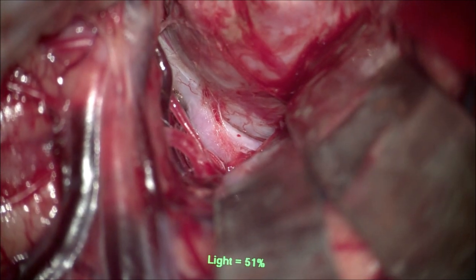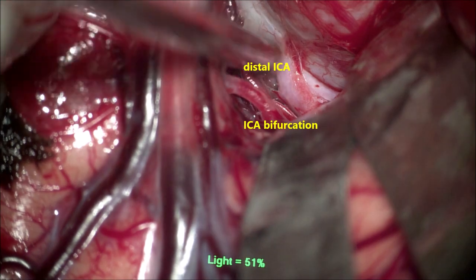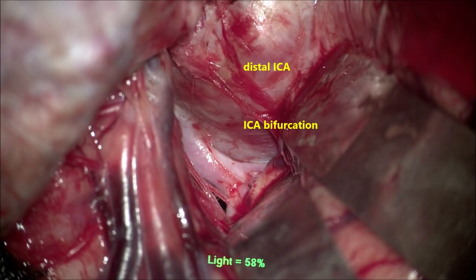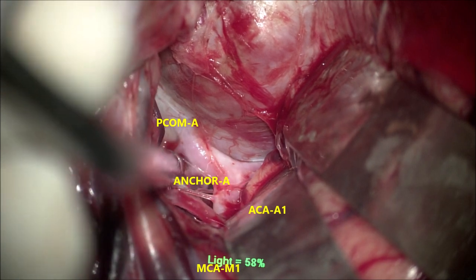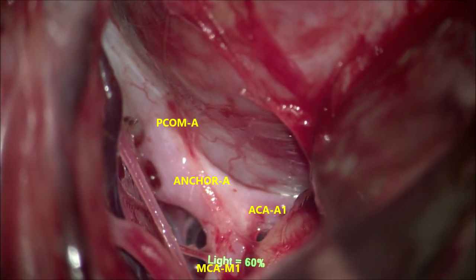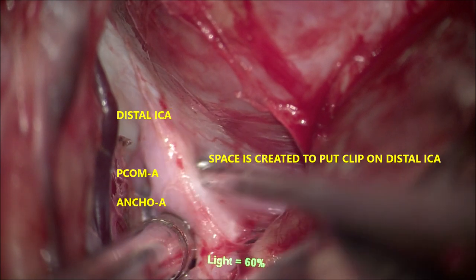Now we can well demonstrate the distal ICA, and the aneurysmal dilatation of the ICA itself in the giant form is clearly seen. We can see the distal ICA, the origin of the posterior communicating artery, and the anterior choroidal artery from the distal ICA. A space must be created between the dome of the aneurysm and the distal ICA to apply the clip. The bifurcation of the ICA into A1 (ACA) and M1 (MCA) is demonstrated medially and laterally, and the perforators originating from the MCA and ICA are not disturbed under any circumstances.